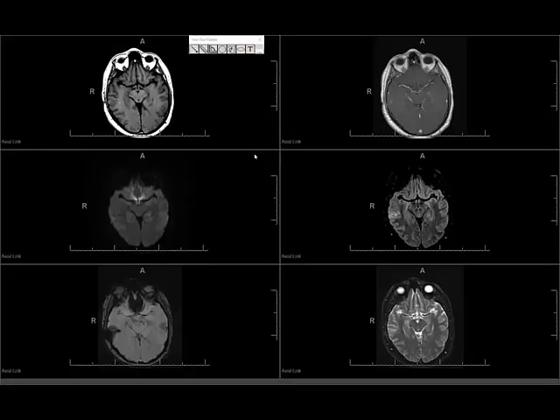Hi, this is Dr. Seigel, and today I wanted to demonstrate how I read an MRI of the brain. This video is primarily focused for the first and second year radiology residents who are just beginning to start looking at MR brains.